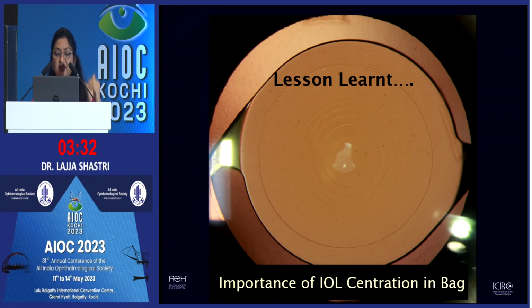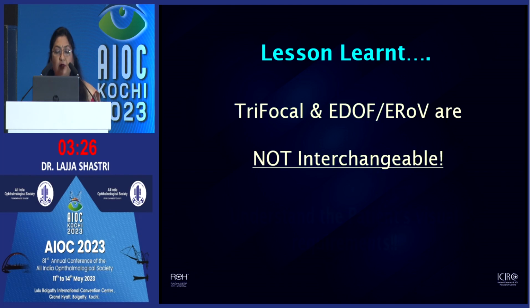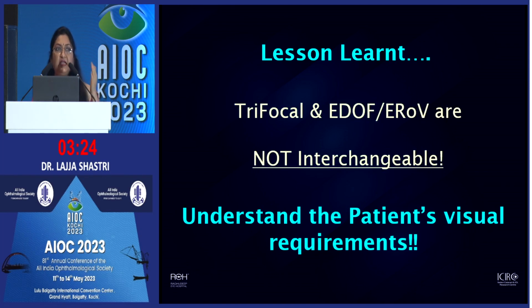So we need to leave behind the lens in a correct manner for it to do a proper job of reaching the kind of refractive outcome we want. Also, trifocal lenses and EDOF or extended range of vision lenses are not interchangeable. They each have a completely different visual performance spectrum. So we need to spend time with the patient, understand what it is that they want, what the eye is suitable for, and then match the lens with that particular eye.